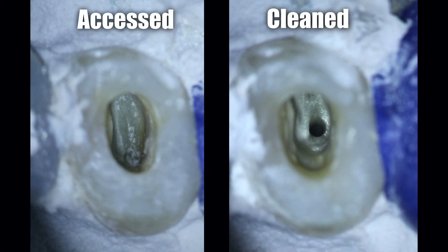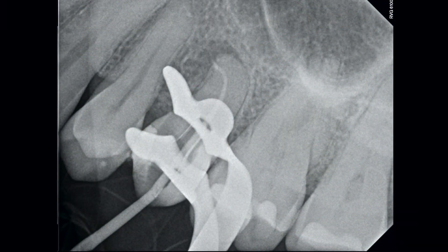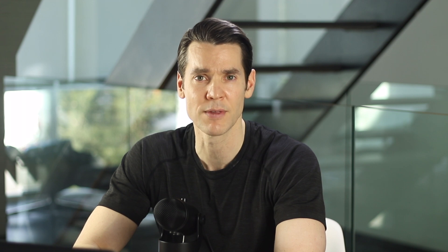After advancing just a few millimeters, I was able to identify a canal. I did make an attempt to look for a second canal, but I was unsuccessful. I captured a cone-fit radiograph, and it showed the canal taking a significant curvature to the mesial with that portal of exit well-centered on that lesion that was also weighted to the mesial. This was a bit of a surprise to me — I wasn't expecting this canal to take a curvature, and I think I got a little bit lucky that my files actually followed the natural pathway of that root canal system.